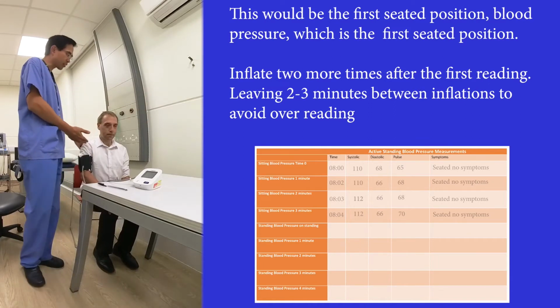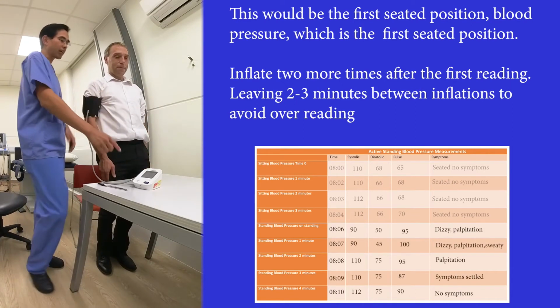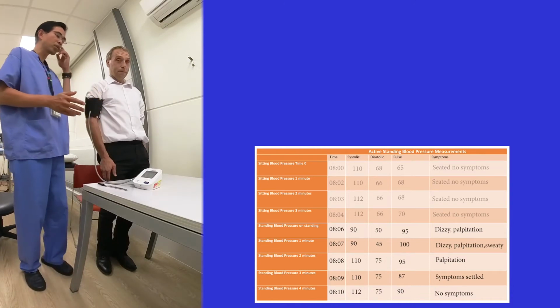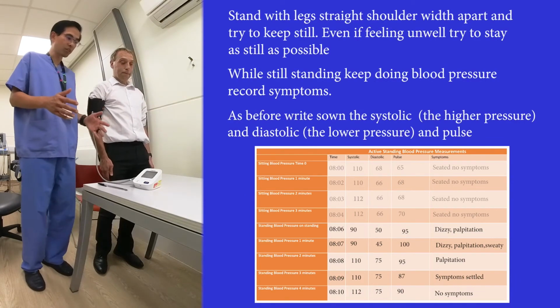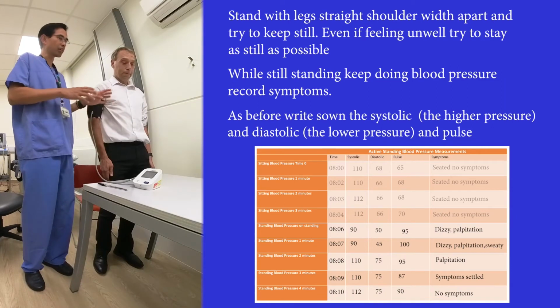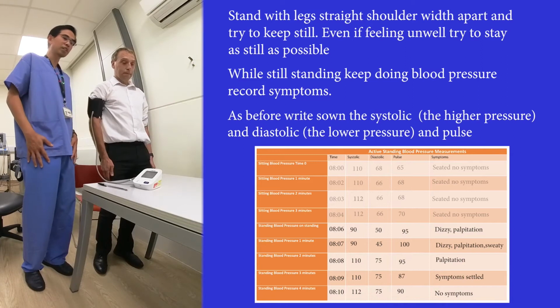Now I'm going to ask Phil to stand up, and this is how we do a standing test. When he stands up, I'm just going to click the button. Phil is standing with his legs shoulder width apart, hands by his side, and importantly, not fidgeting his legs. He's not moving his legs, he's not bouncing his legs. Even if he feels unwell, he's going to try not to mobilize or move his legs.